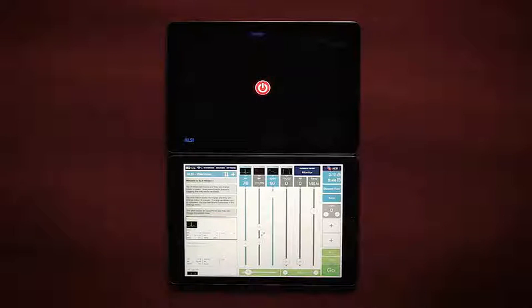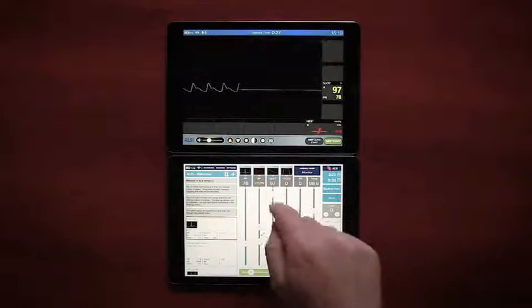Today we're going to take a moment and go through our welcome scenario, which is a custom scenario we've put together to showcase some of the features of ALSi. So we're going to turn the power button on here within our monitor.